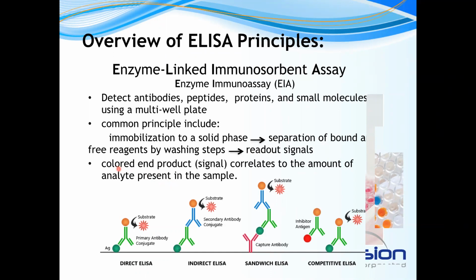So the colored end product that generates signals correlates to the amount of the analyte present in the sample.